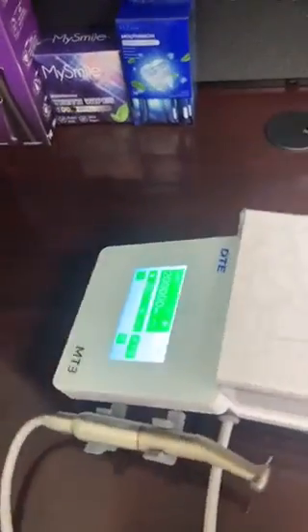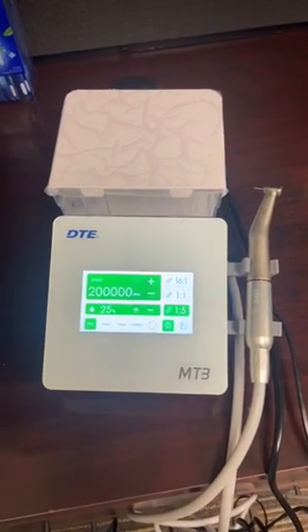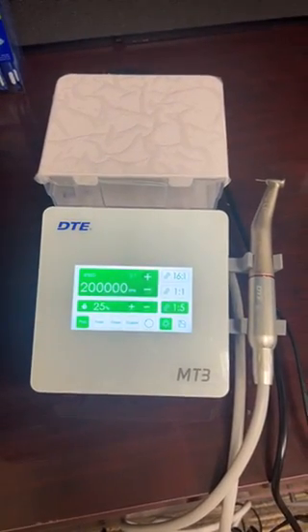So for the most part, the MT3 is a completely standalone unit, very easy to operate. If there are any questions, let us know.